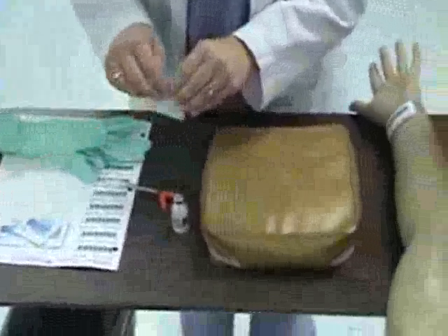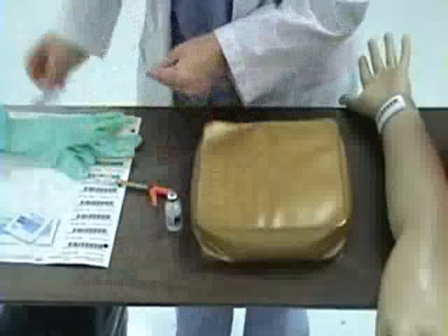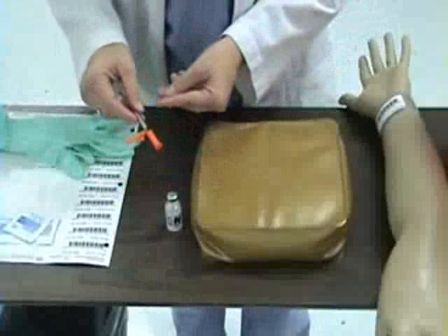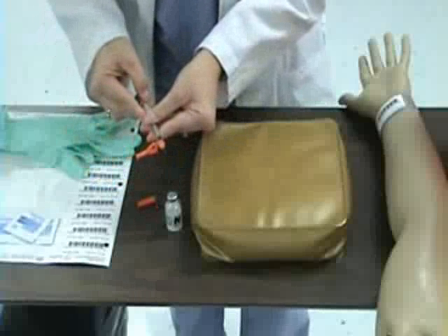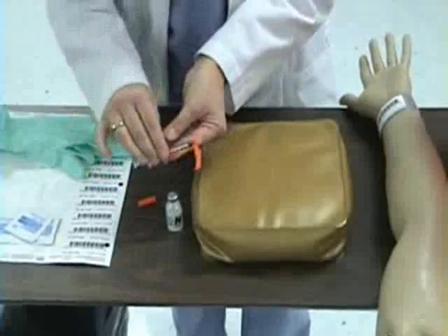I'm going to begin by cleansing my vial with an alcohol prep. Today I will be giving 10 units of insulin. I'm going to begin by removing the cap, withdrawing 10 units of air.